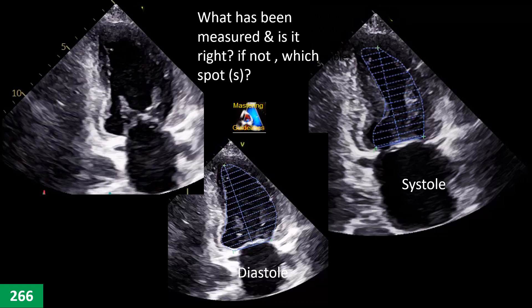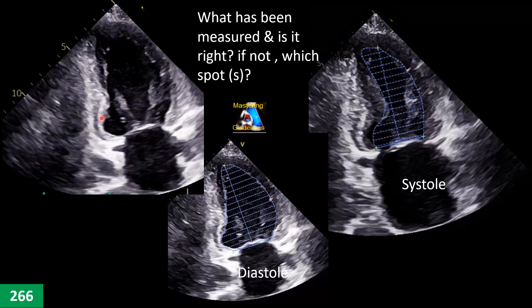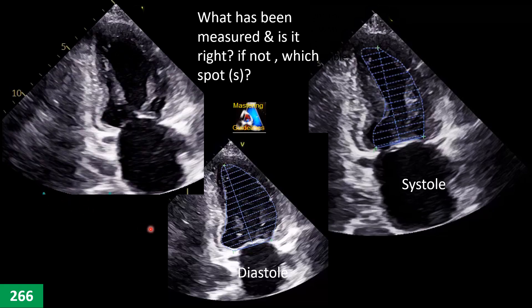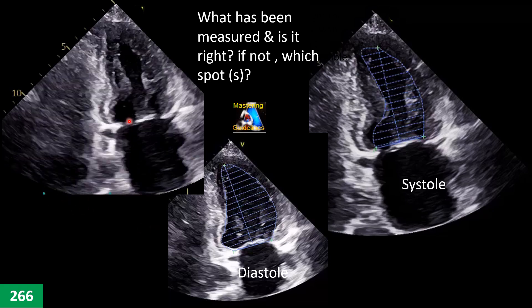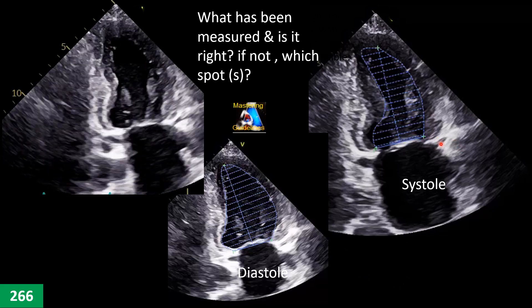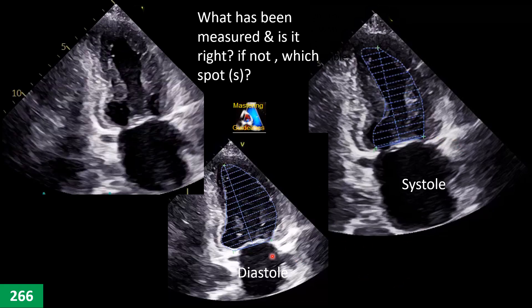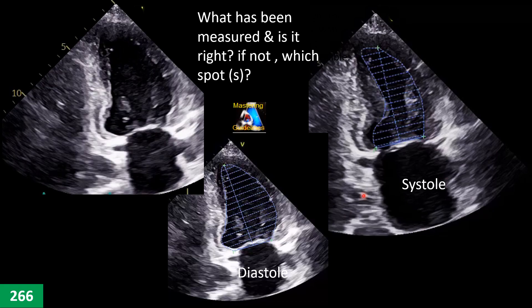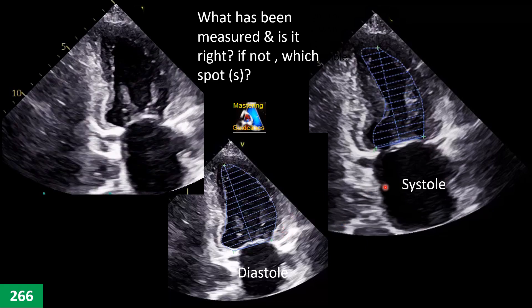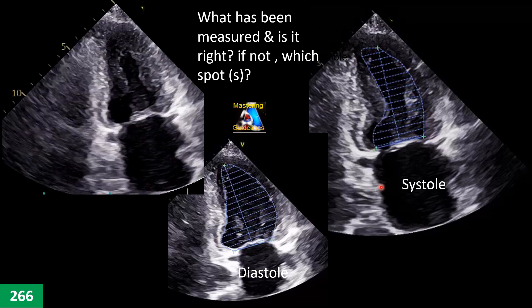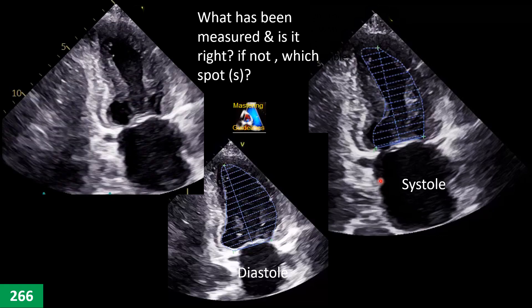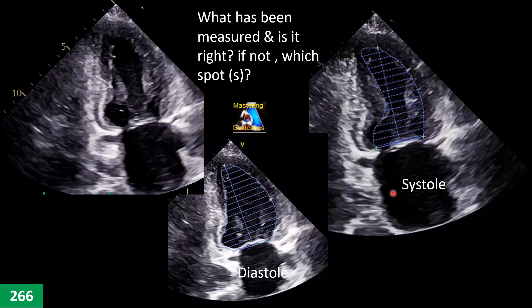Let's do it. Here is a patient — apical two-chamber view. The tech has done tracing on the diastole and systole. Are any of them correct or wrong? If wrong, what is the correct way and how can we fix it?